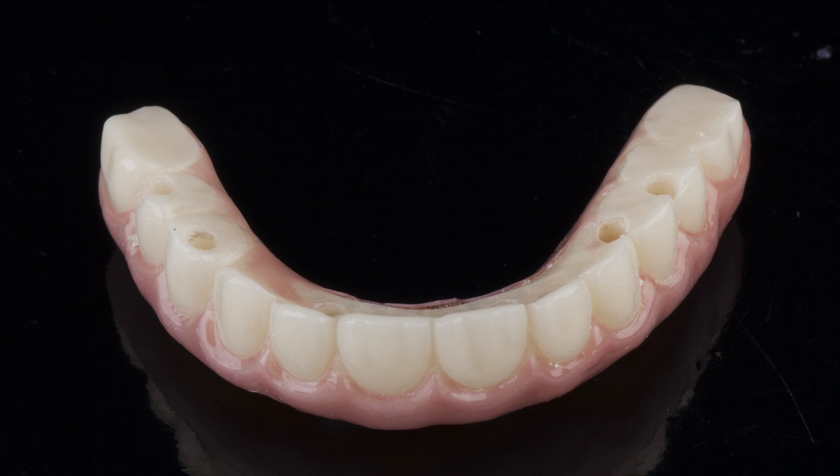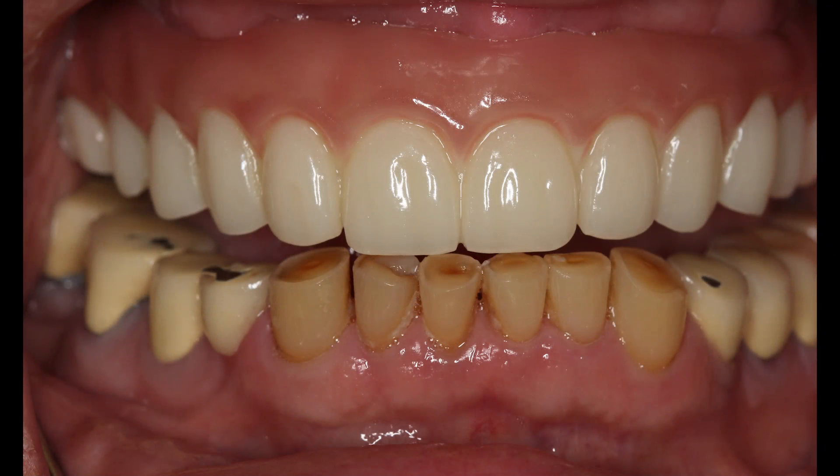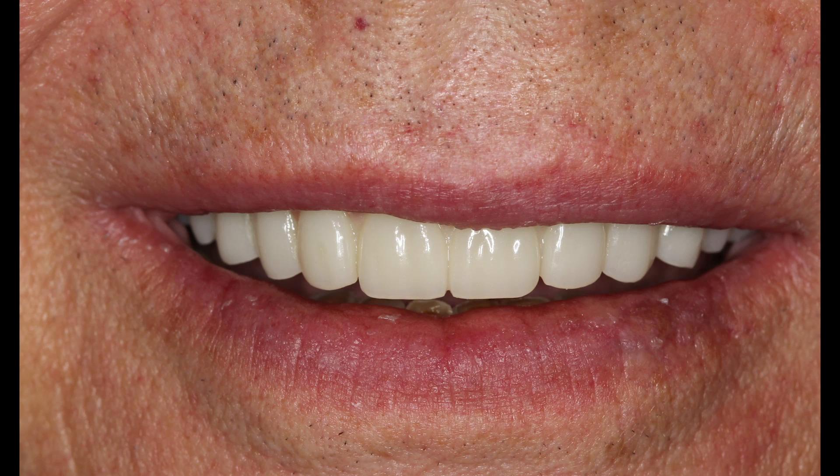Next, the provisional implant prosthesis was milled, replicating the form of the approved setup. This temporary restoration is produced from polymethyl methacrylate, which is easily modified, yet durable. In addition to providing the patient with a functional prosthesis while the final restoration is fabricated, the provisional adds one last layer of quality control, giving the patient and doctor an opportunity to verify the definitive design before the final prosthesis is milled from the Bruxer solid zirconia. The provisional appliance was seated at the next appointment and the occlusion, function, and aesthetics were verified. The screw access holes were covered so that the provisional could be left in place to serve as an interim prosthesis while the final restoration was fabricated by the lab.